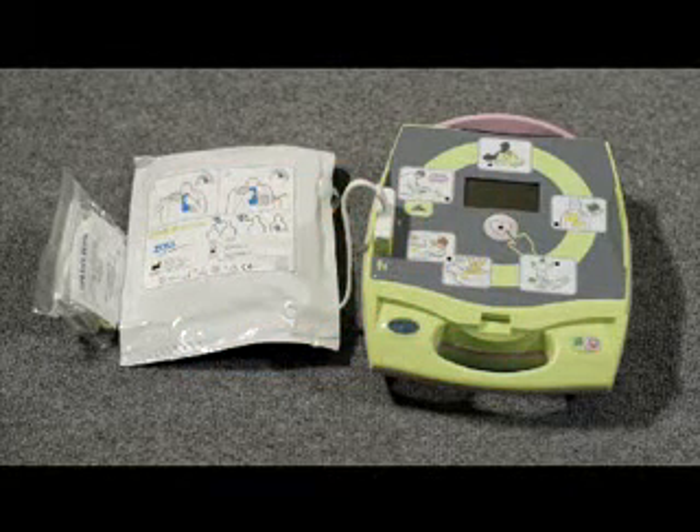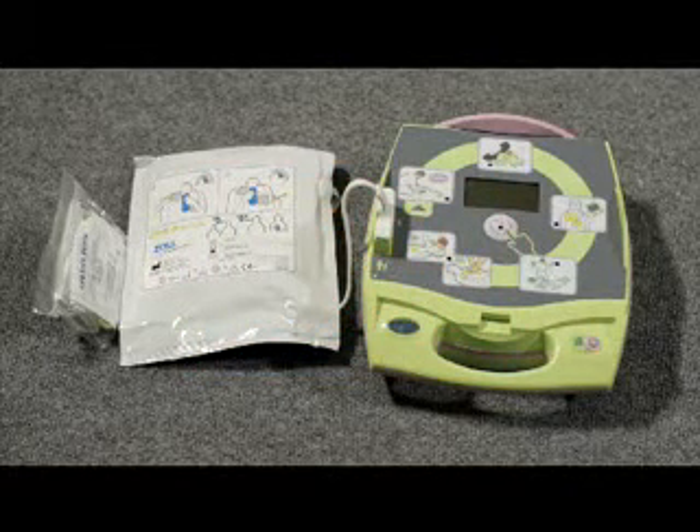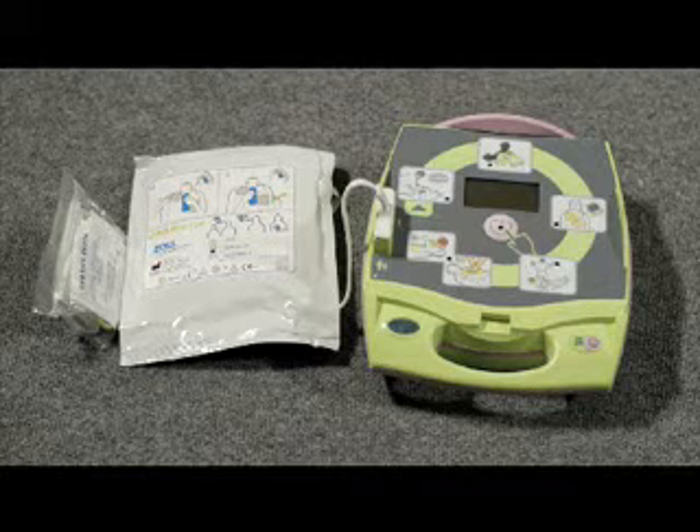An AED is used to correct or restart a person's heart rhythm. AEDs can be used for adults and children.